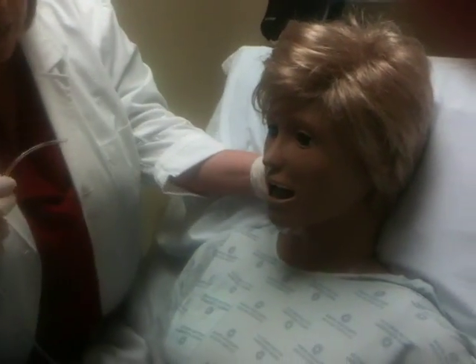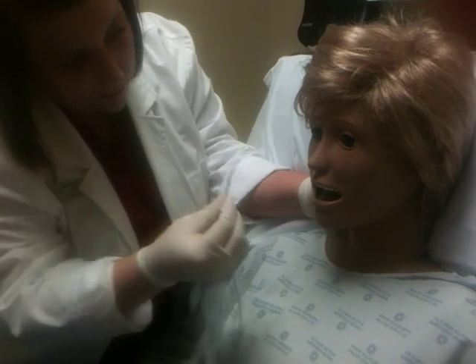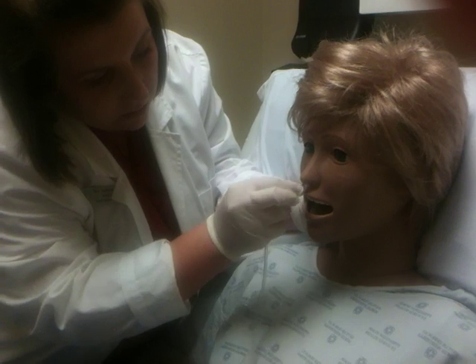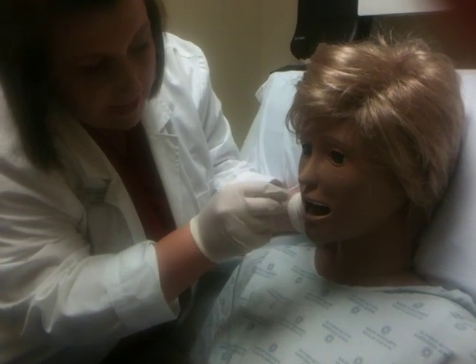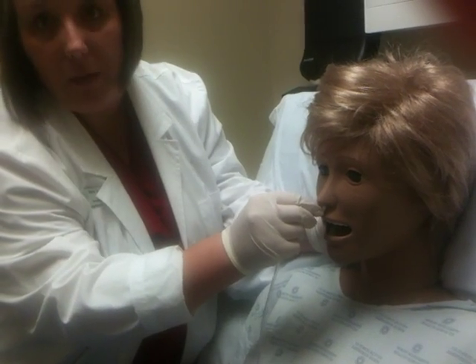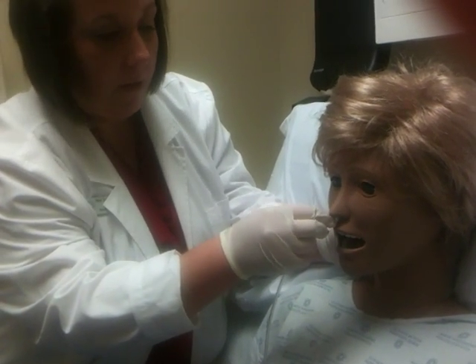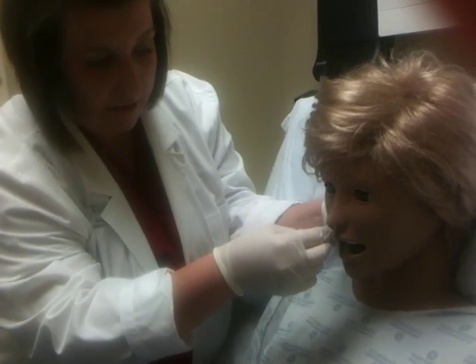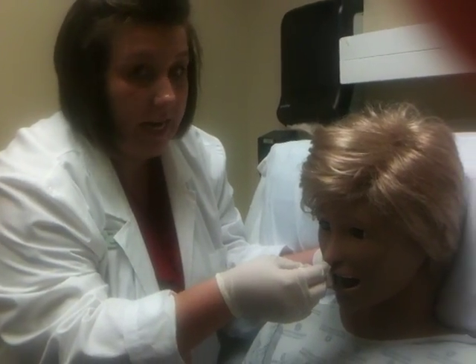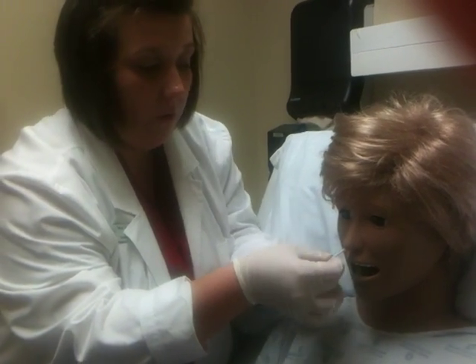All right, Miss Smith, we're getting ready to get started, okay? I'll go ahead and insert. And they may start being a little uncomfortable. And she gives me a thumbs up that it's in the back of her throat. All right? So I would ask her to flex her head forward. What this does is decrease the chances of it going into the trachea. So she flexes her head forward.